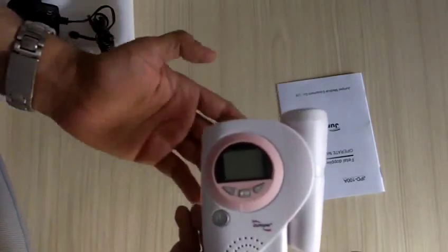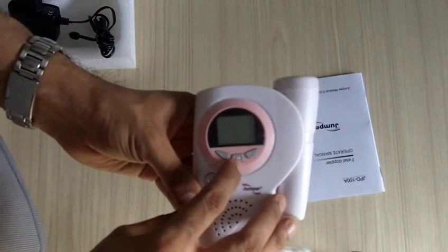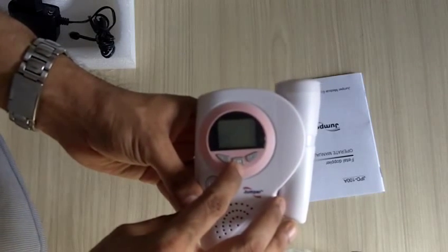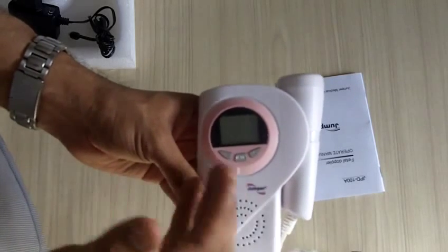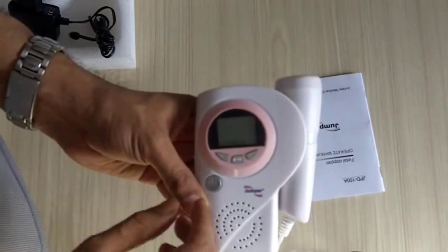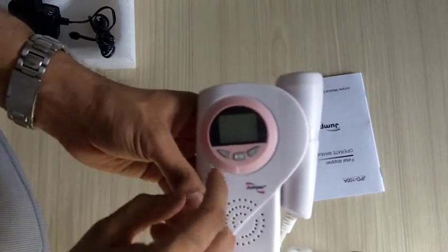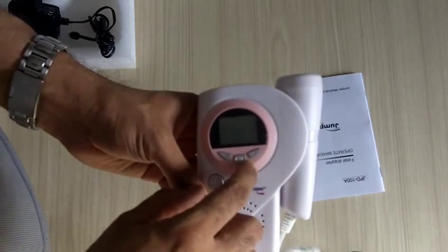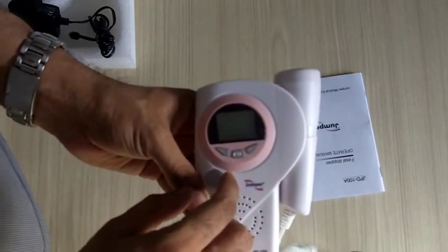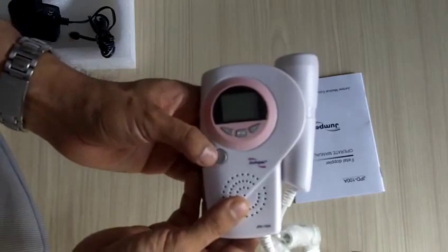This machine has three buttons. The center button is for mode, and you can choose between manual, automatic, and transient mode. The default mode is transient, which gives you the actual reading as you are seeing. The other two buttons are plus and minus for audio control — you can increase the audio from zero to eight levels depending on your personal preference.